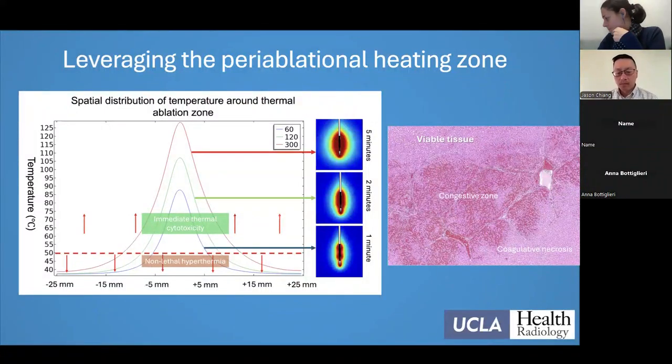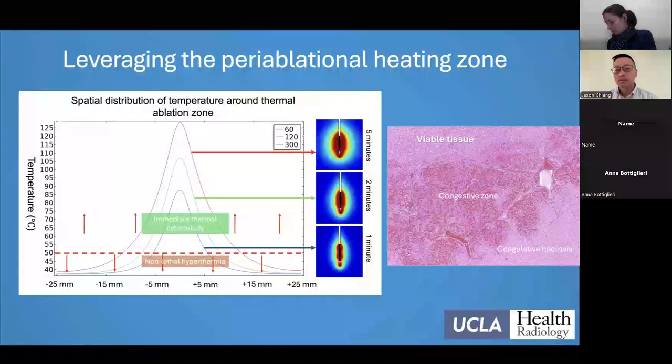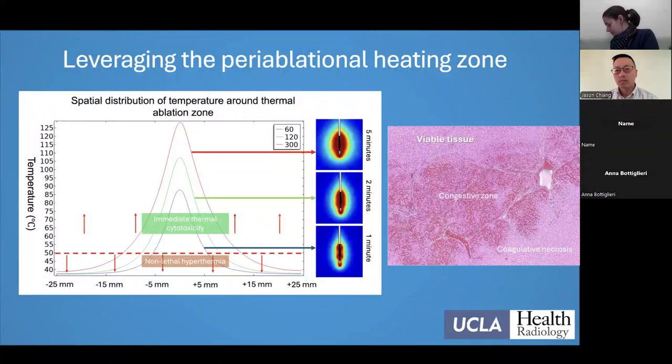But these clinical trials, if I remember correctly, for example IMbrave phase 3, selected patients who had already received surgery or microwave or radiofrequency ablation. Do you think they were selected to intentionally receive, let's say, suboptimal ablation, or were they just selected based on, I don't know, the database? Yeah, that's a great question. For IMbrave, I think they were mostly early.